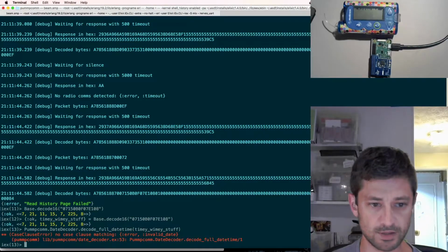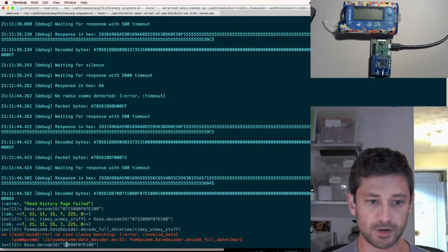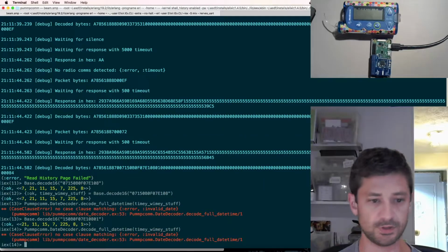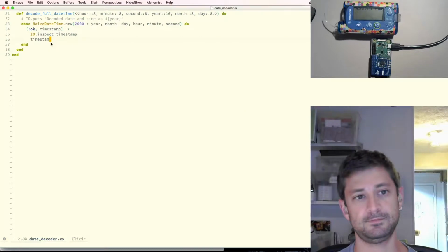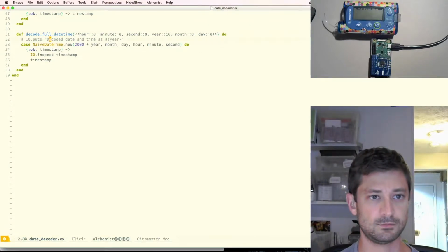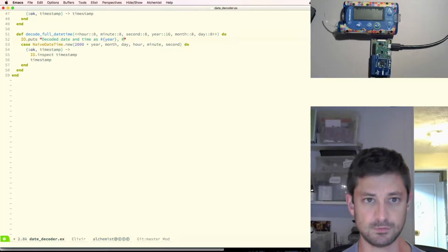All right, invalid. Okay, so if I take this first byte off and add the last one on, still invalid. Fine. Puts driven development it is.